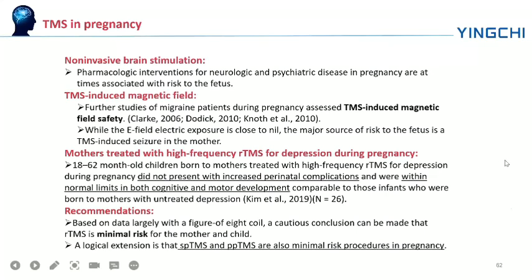And while the E-field electric exposure is close to nil, the major source of risk to the fetus is a TMS-induced seizure in the mother. So for people who are pregnant, their parameters need to be determined carefully.